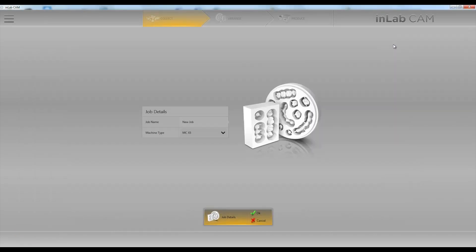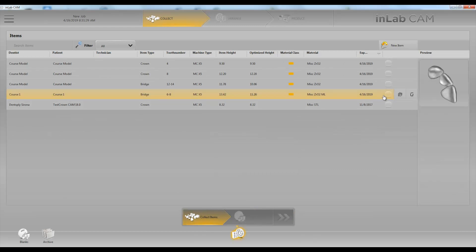First thing we're going to do is click on New Job. Choose MCX5, and we're going to choose the restorations we want to mill.